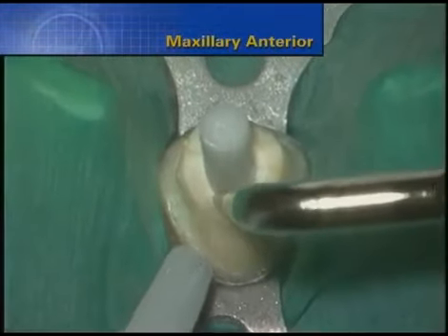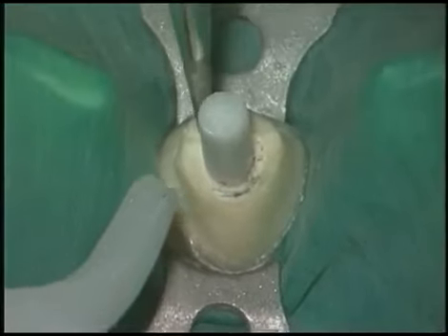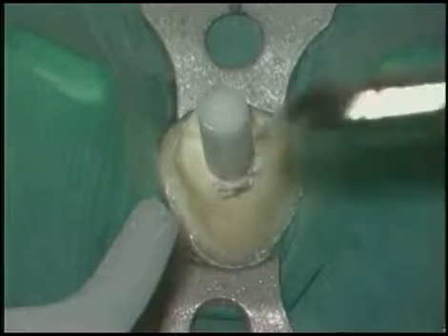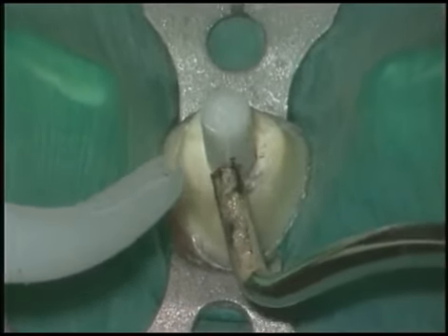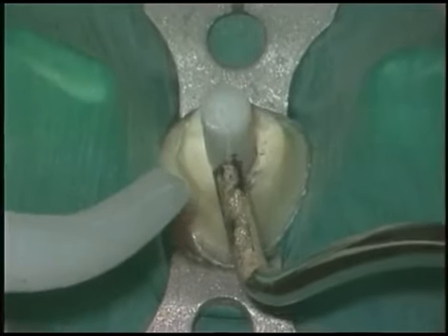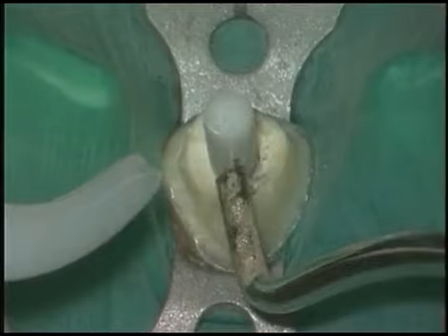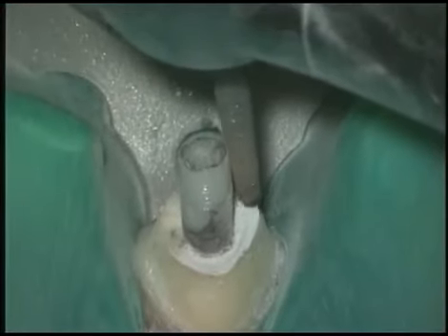Here is a maxillary central incisor with a large fiber post. Specifically, this is a Serra post distributed by Brasseler. Ultrasonics is not that successful typically to remove these posts because in the advent of aesthetic dentistry and adhesion dentistry, these posts are substantially more secure in their roots than their metal post counterparts.